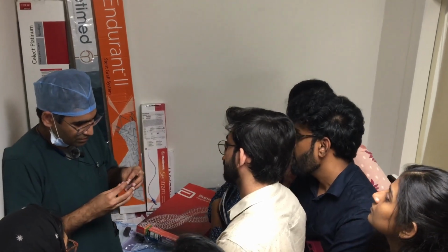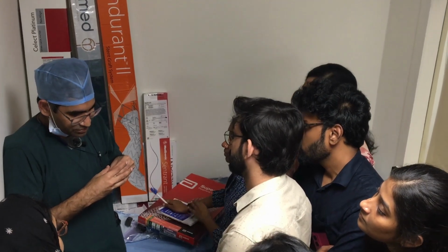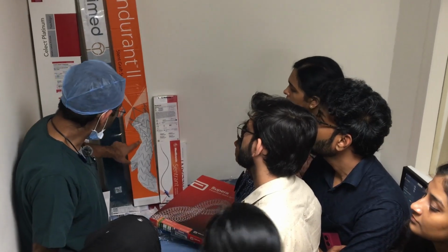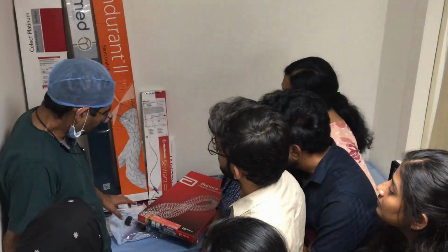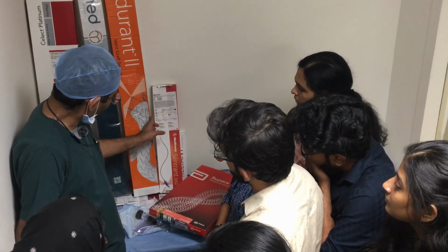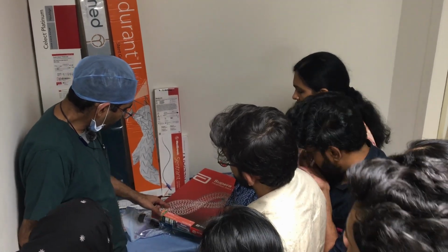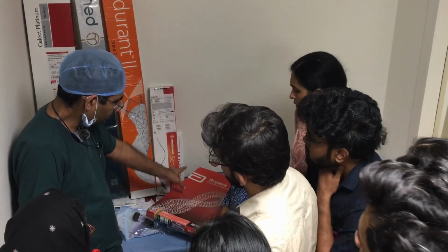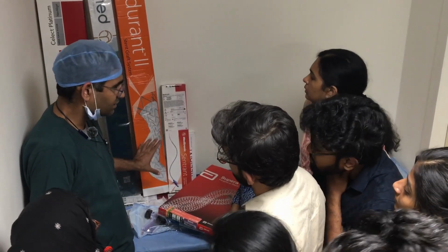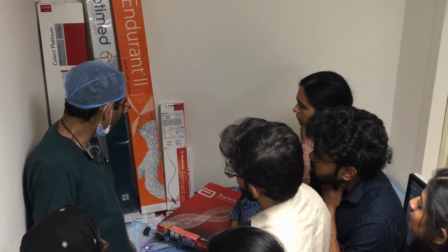In the center, which goes against the lesion, they will have closed cells, and at the ends they will have open cells. This is a stent graft. So basically, how does the stent differ from the stent graft? They have a fabric inside. This one does not have fabric, so blood can enter the stent and come out through any of the branches, or if there are branches, they will be preserved. In this one, if there are branches, they will be covered, and blood enters from one end and comes out from the other end.